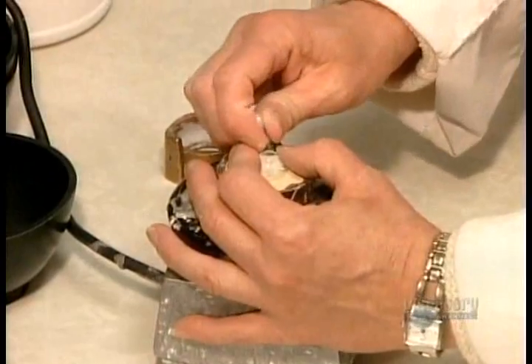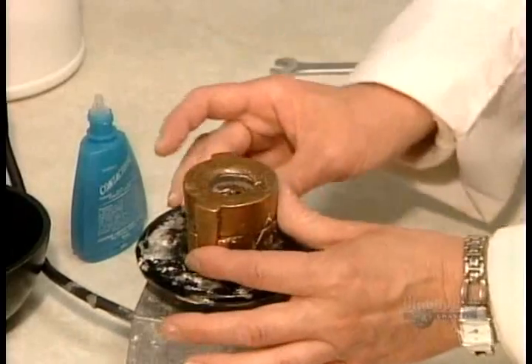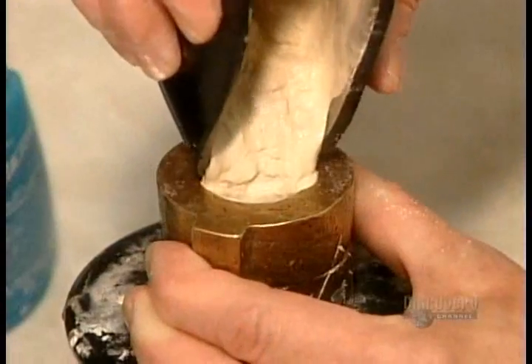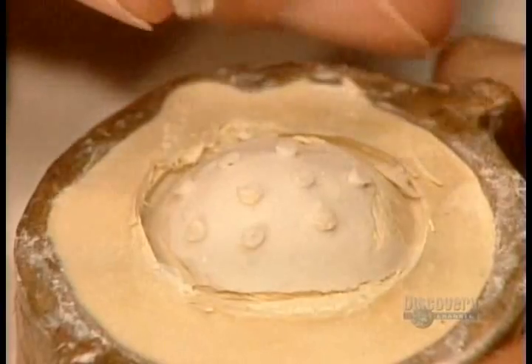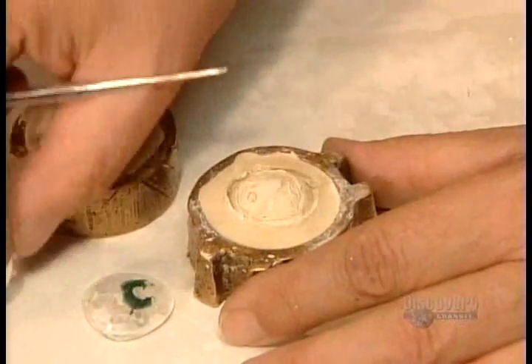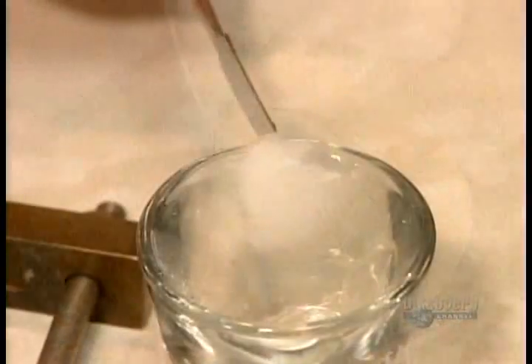They place the impression in a mould and pour in a type of plaster. When the plaster has hardened, they remove the impression tray and then the impression itself. What's left in the mould is a plaster replica of the socket.